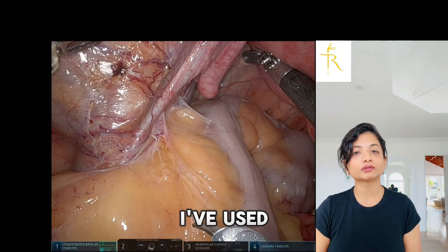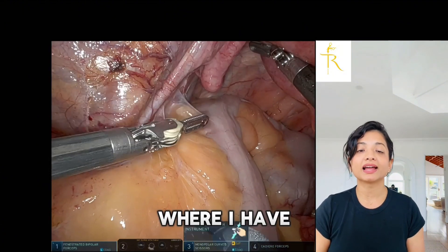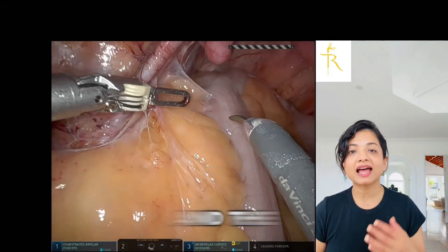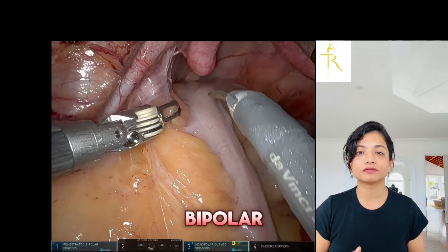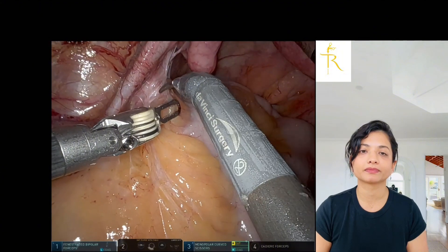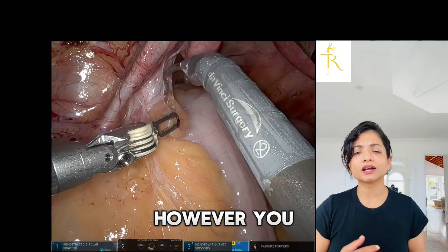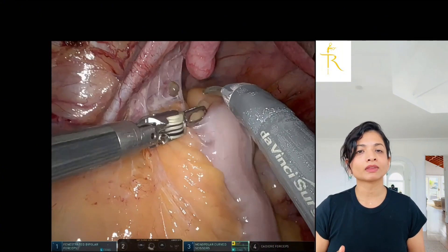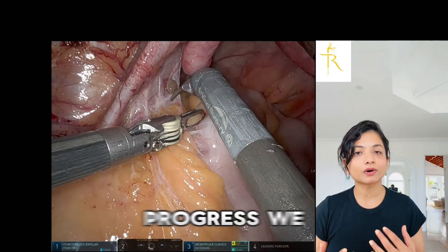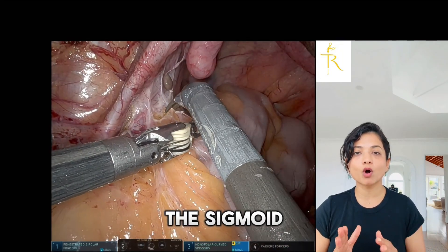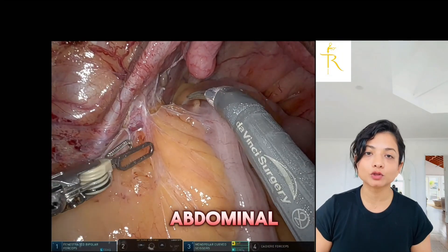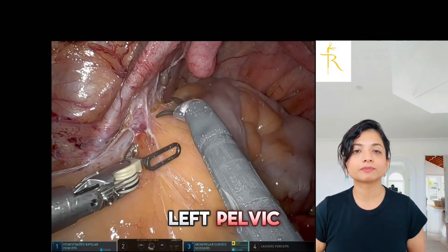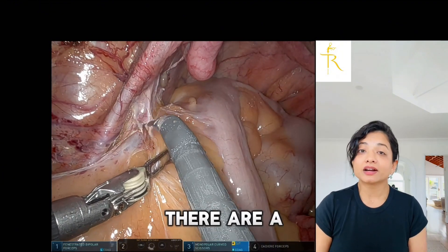In this scenario I've used the robotic approach, where I have monopolar scissors on my right hand and the fenestrated bipolar forceps on the left. However, you will see I do not tend to use a lot of bipolar energy as we progress. We separate the sigmoid colon from the lateral abdominal wall, working towards the left pelvic side wall.